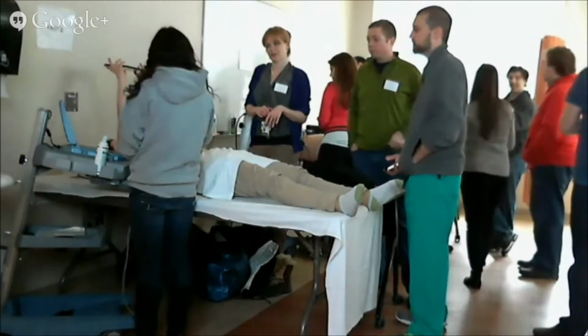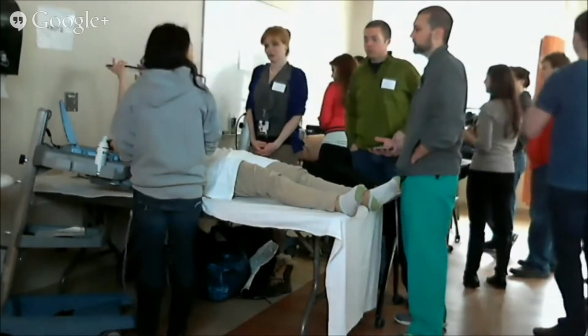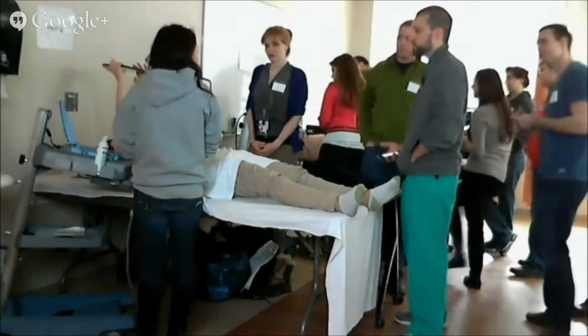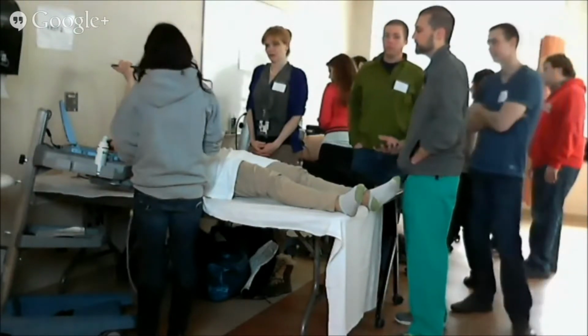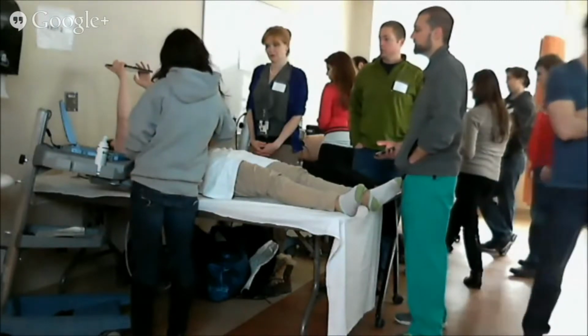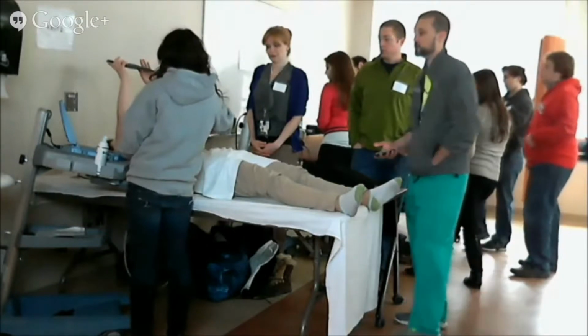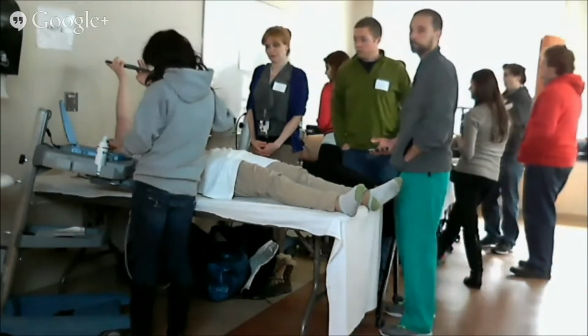That tells you so much right there, right? Because you got the diaphragm, you got the liver, you got the Morrison's pouch, everything right there. And that's when I'll switch my hand to the top of the probe. That way I can shoot down into the chest and make sure to increase your depth.